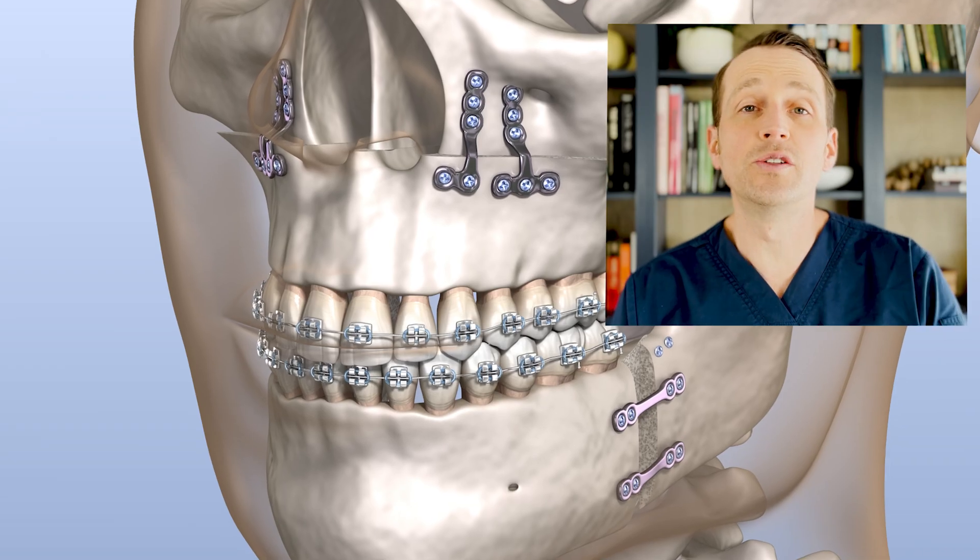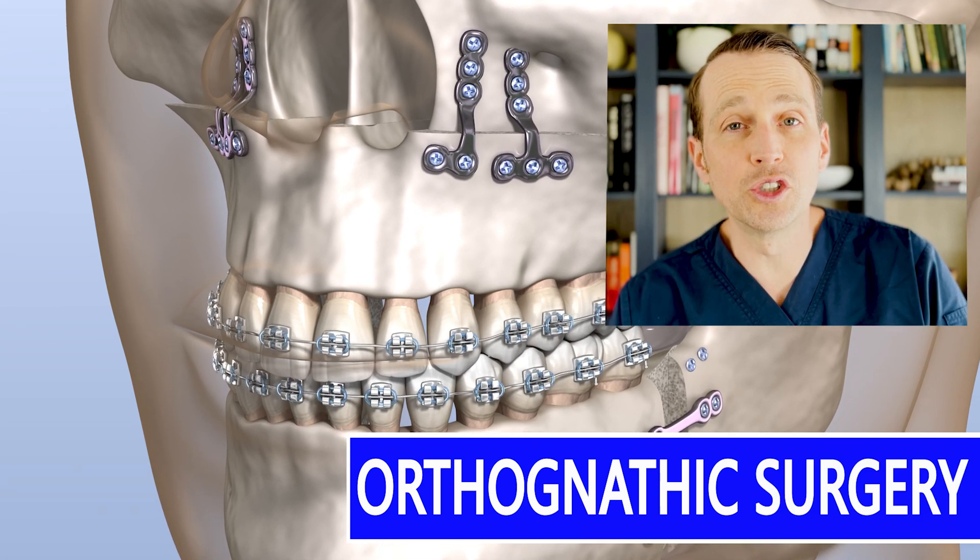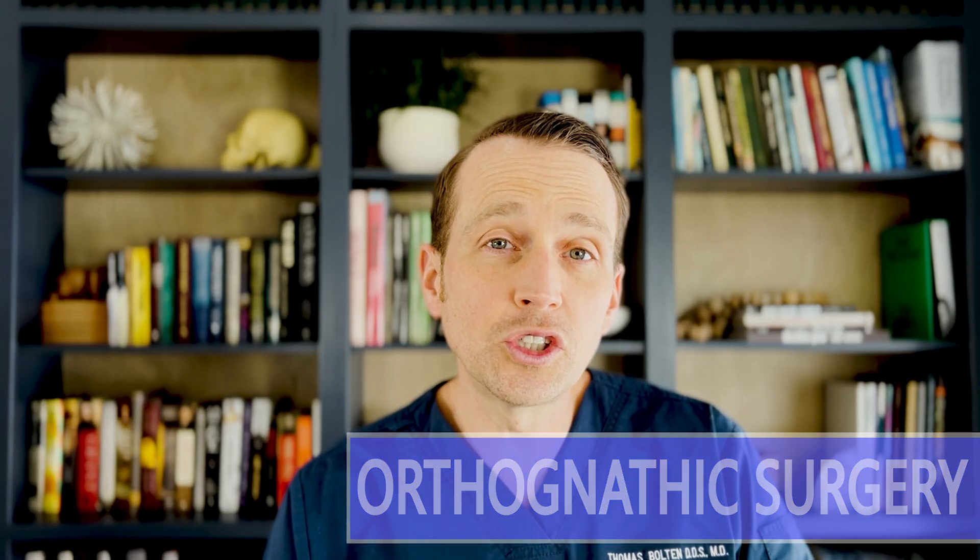Jaw repositioning surgery, otherwise known as orthognathic surgery, is one of the most life-changing and rewarding procedures we do. Let's check out a full surgical case today on The Open Reduction.